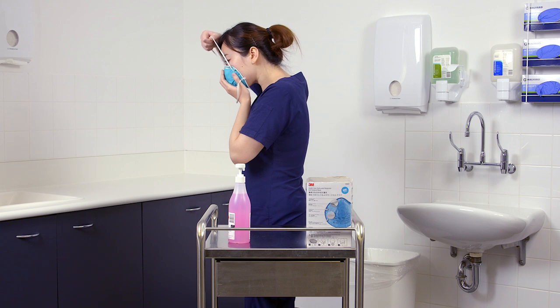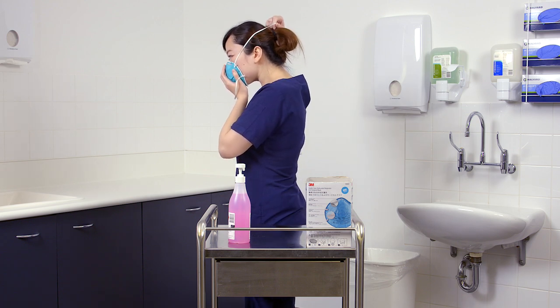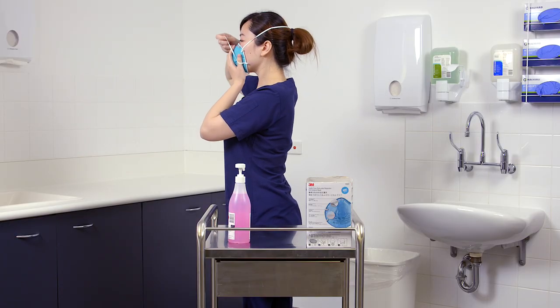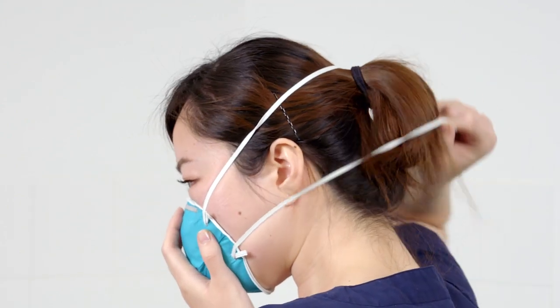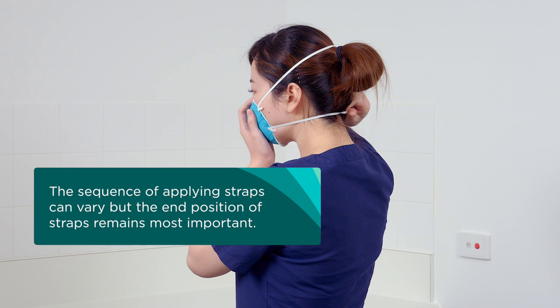Keeping one hand on the respirator, pull the top strap over the top of your head and rest it high on the crown of your head. Pull the bottom strap over your head, then position it around your neck and below your ears. The straps must not be twisted. The sequence of applying straps can vary, but the end position of straps remains most important.